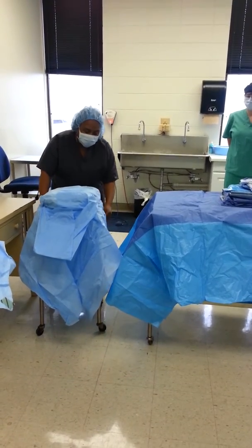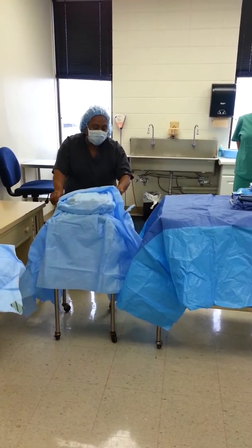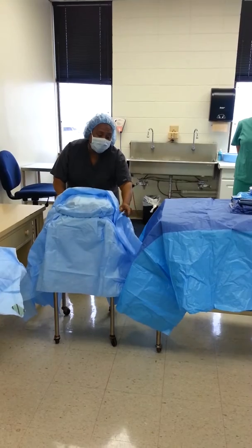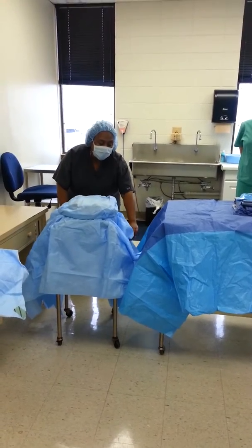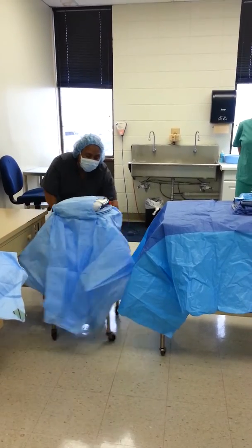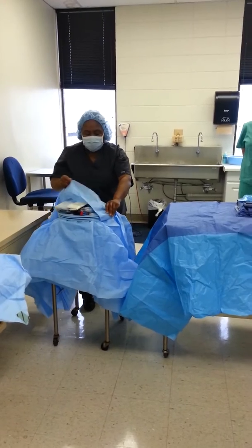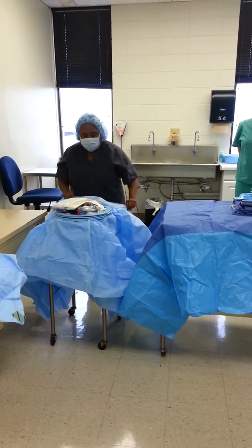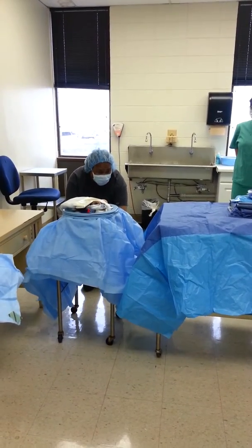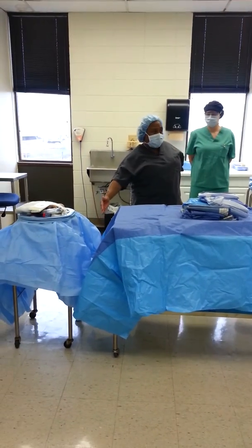Okay, so now I'm turning. I'm looking for the rough edge. I see it's here. And I need to make sure, see this end that's below, that it doesn't touch my table there. So I'm pulling gently down so that it doesn't pop on top of my table. And I can just push that a little closer, because I don't want anybody to come and try to walk through there.